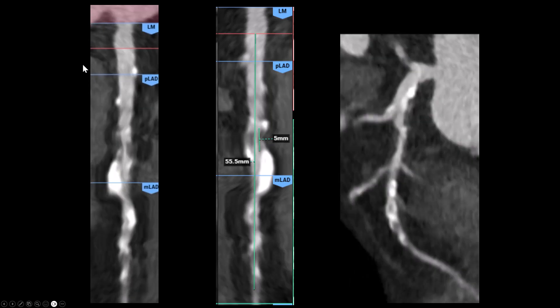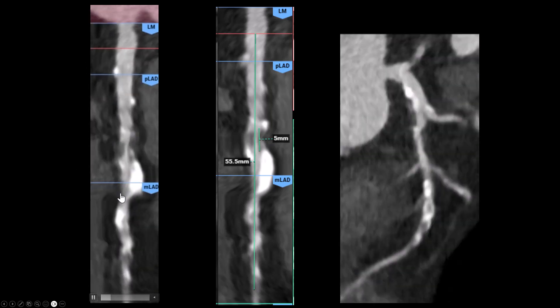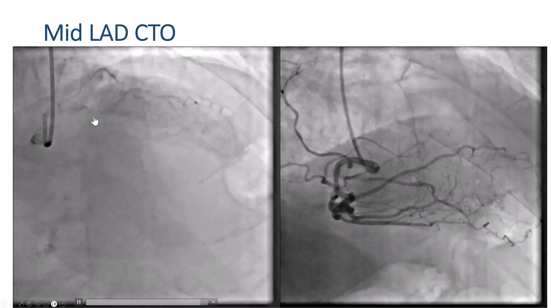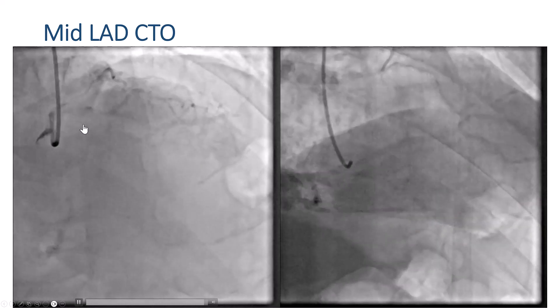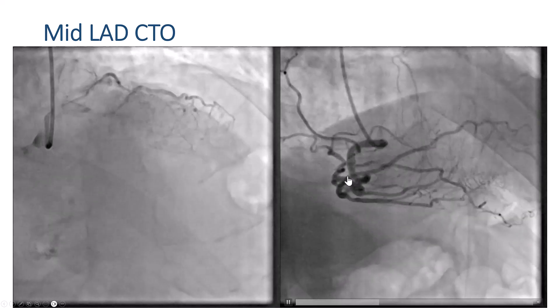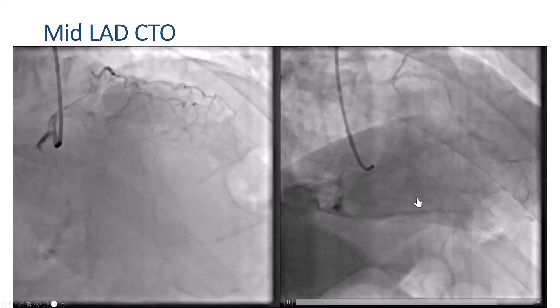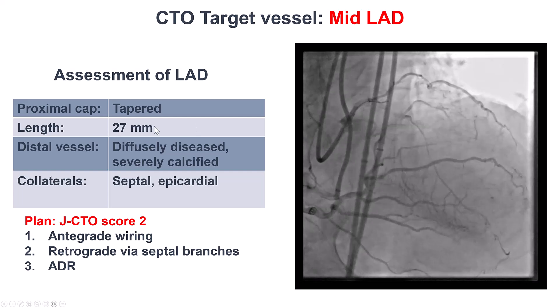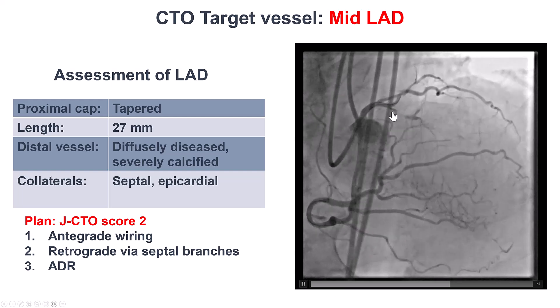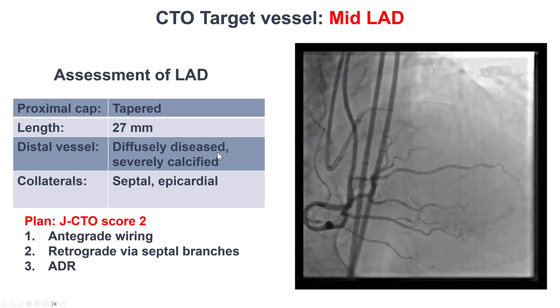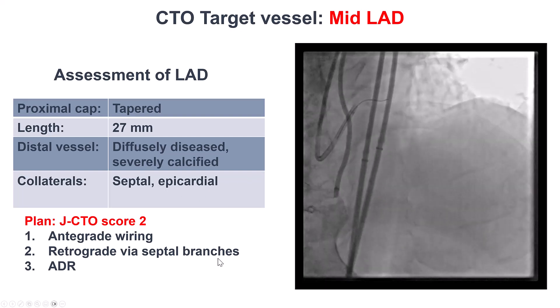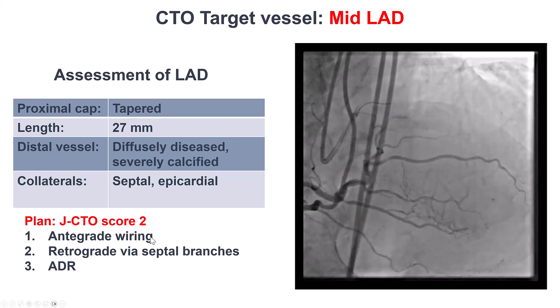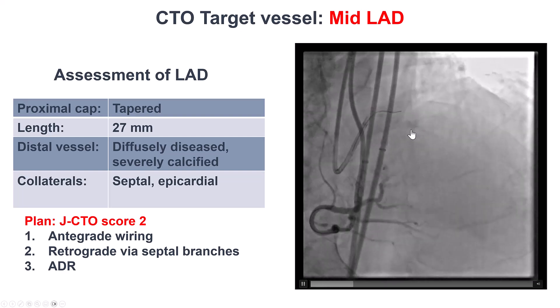These are the multi-planar reconstructions showing the significant eccentric calcification distally. On the coronary angiogram, as suspected from the CT, the occlusion is fairly short. We see calcium especially distally and also some calcium proximal. The right coronary artery seems okay, and there are epicardial as well as septal collaterals supplying the LAD. Based on the dual injection, we have a tapered entry, a short occlusion length, diffusely diseased distal vessel, and calcification, with both septal and epicardial collaterals. Our plan was to try antegrade wiring first; if that didn't work, retrograde through septals, leaving ADR as the last option because of several diagonal and septal branches near the occlusion.